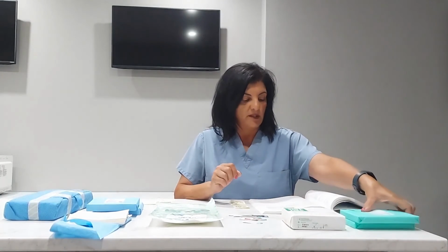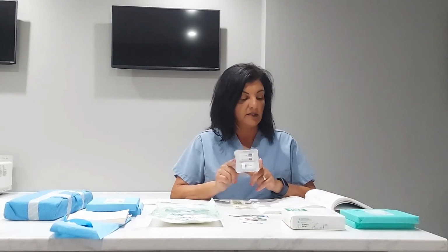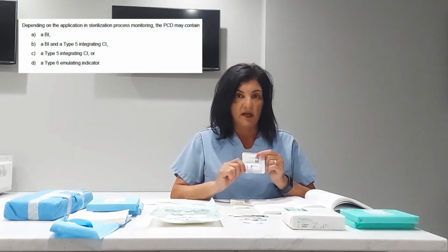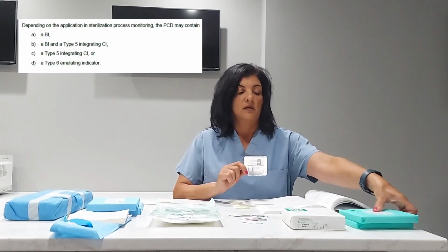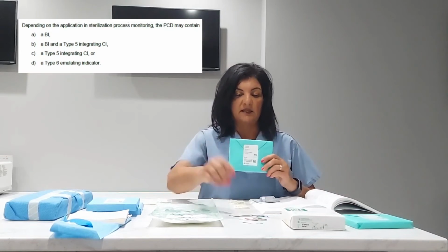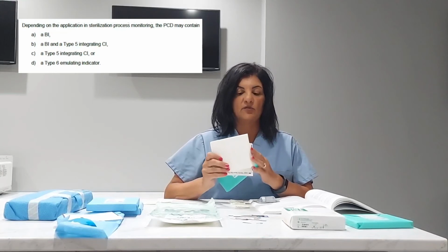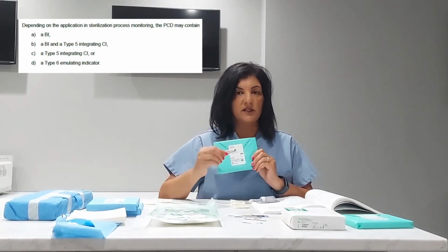The other thing I wanted to touch on, if you look at page 81, is process challenge devices, or PCDs. Typically, this particular brand can contain a BI, or a BI and a chemical indicator class 5, or like this process challenge device contains a class 5, and then it's got all the cards inside of it like your Bowie-Dick, so that it is challenging the sterilization of the indicator inside of it.